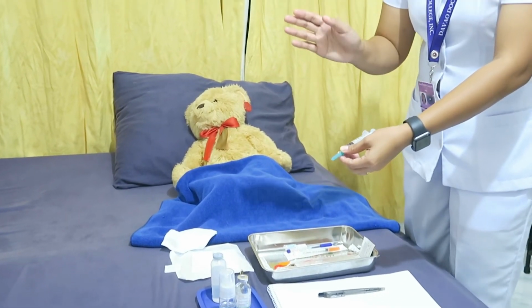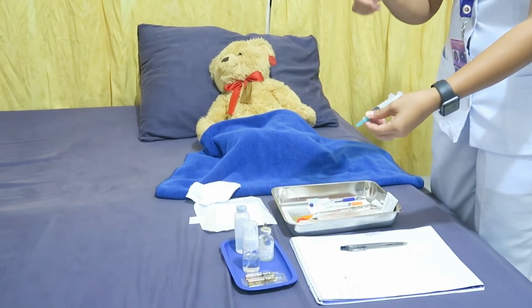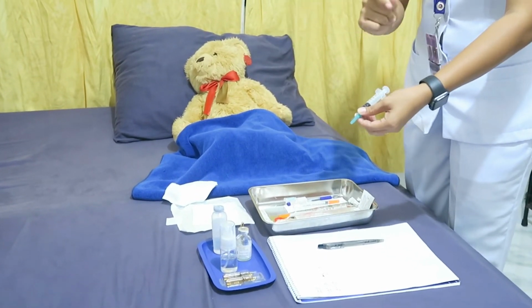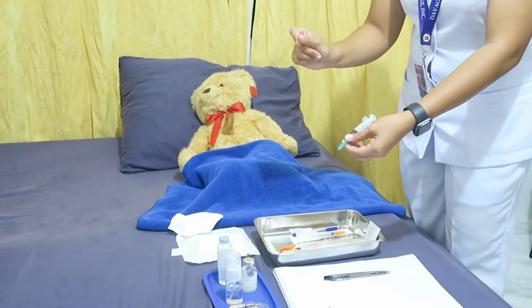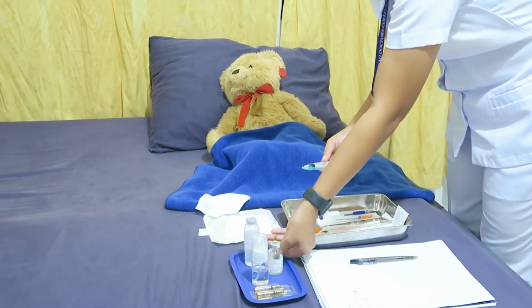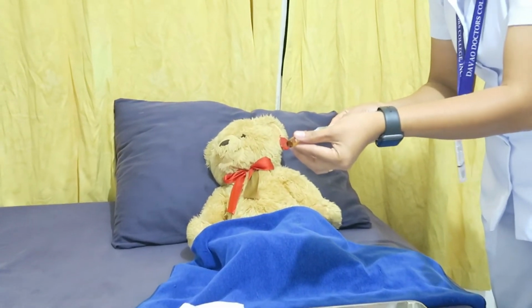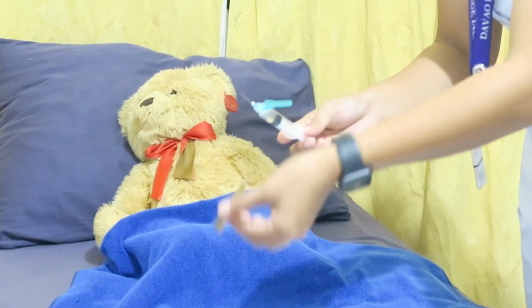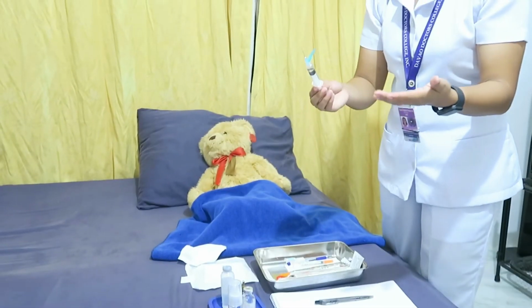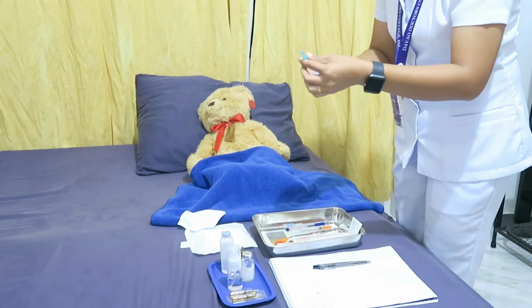So, with a single dose ampule, hold the ampule slightly on its side if necessary to obtain more than the ordered amount of medication. Then, after that, dispose of the filter needle by placing it in a sharps container. Then, if giving an injection, replace the filter needle with a regular needle.